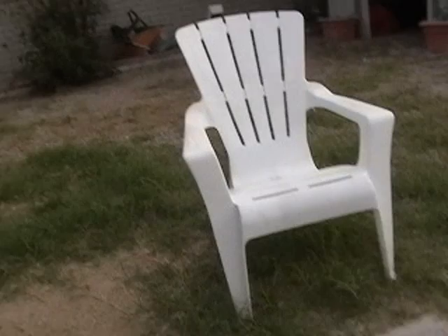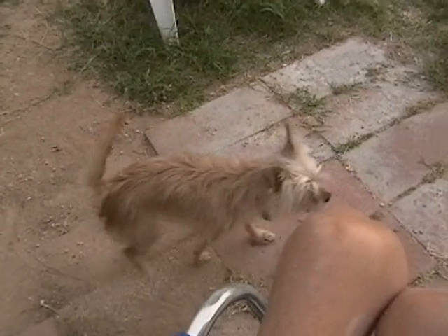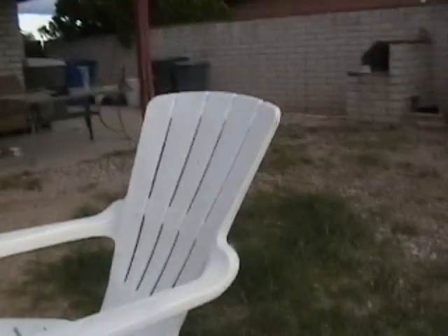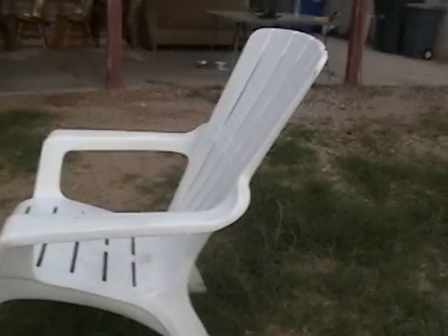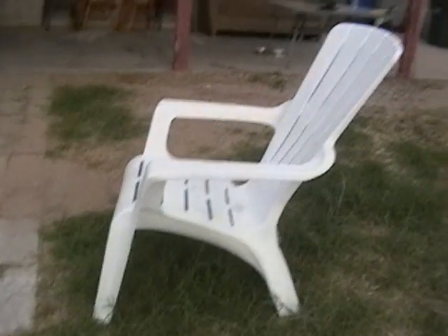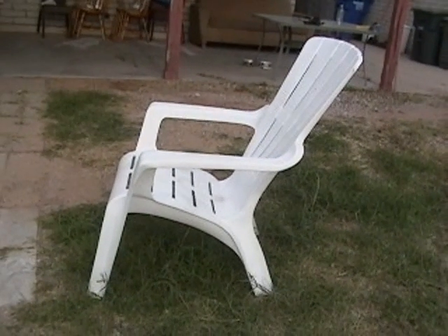Looking at one of our plastic summer chairs, I was thinking about how comfortable it was, and how difficult it would be to transfer into from my wheelchair. I thought I'd give it a try. The legs are pretty low to the ground, so I think it's probably pretty stable.